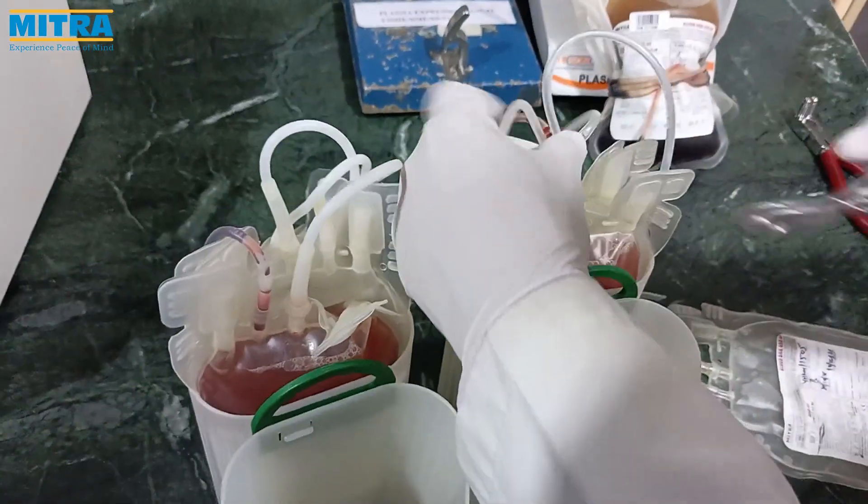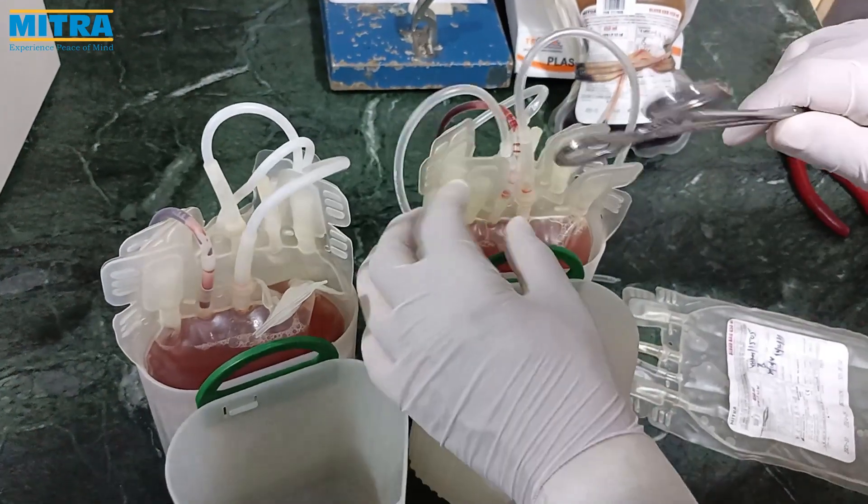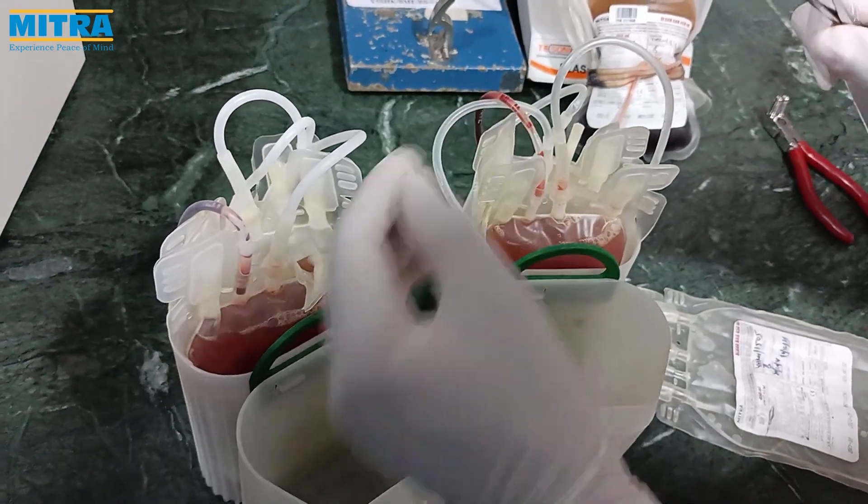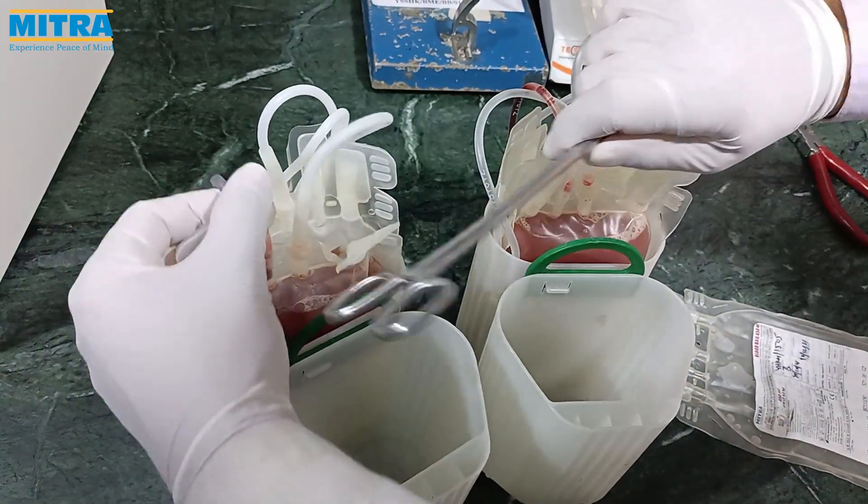Now we tap the ports so that any trapped blood is expressed back, to prevent red cell contamination after centrifugation.